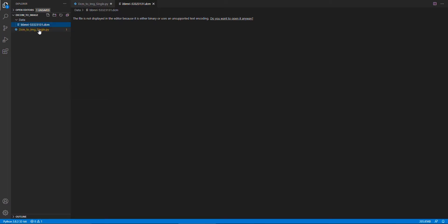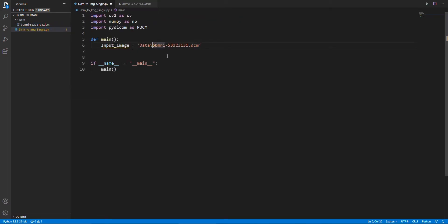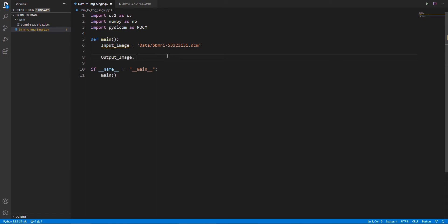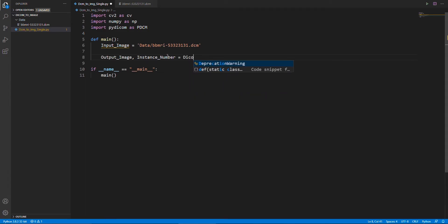In this program we will read a single file to process. The input file path can be copied easily with this software and we can paste it here. We will write a separate function to process our file and return the 8-bit image and the actual instance and slice number. After getting back our processed image, we will save the result with its slice number.